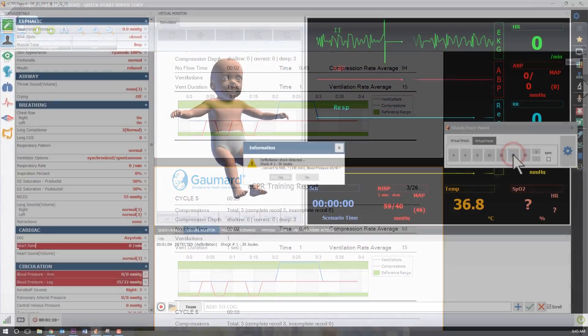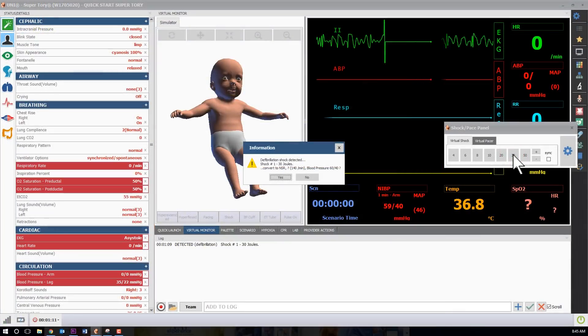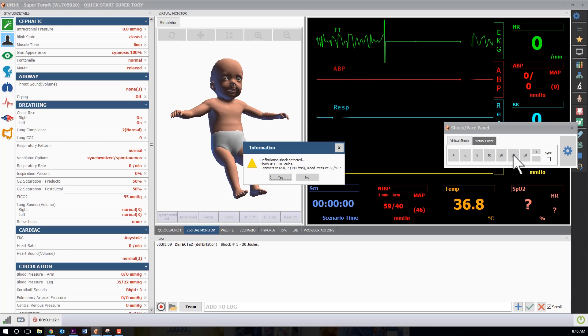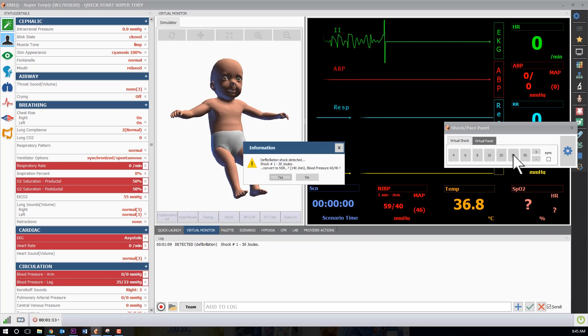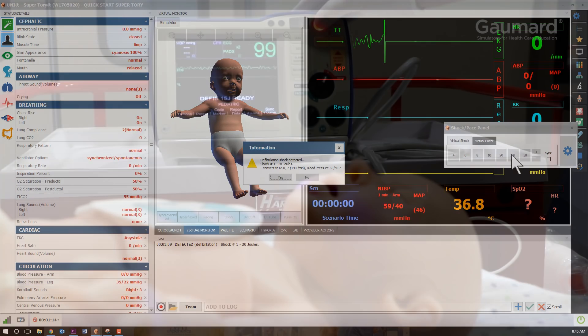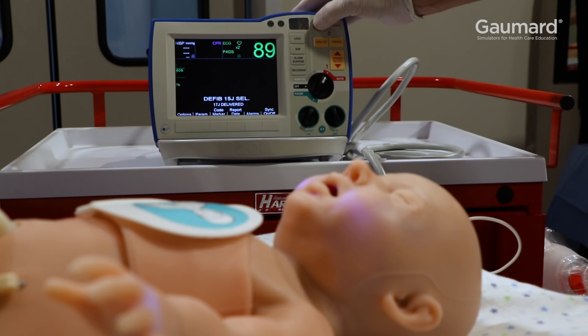SuperTori can be defibrillated by way of virtual shock using the panel or using live energy with a real defibrillator.